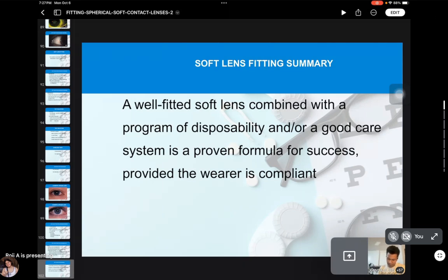Rika, are you there? Can I share about the contact lens that got dried up? So there was a question, right? You asked me, is it still good? Actually, it's not good anymore because the parameter is already changed. Remember, in soft contact lens, if you are not going to use it, you need to soak it right away.